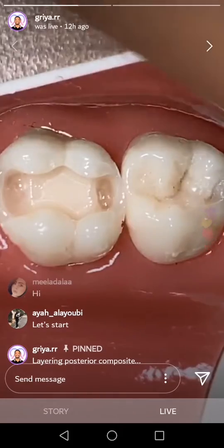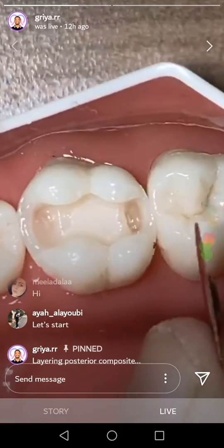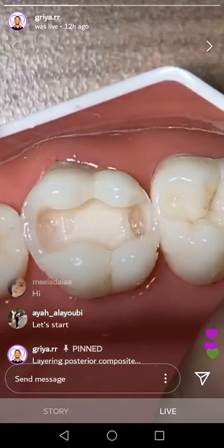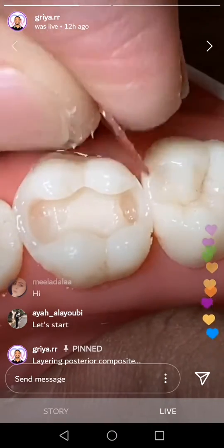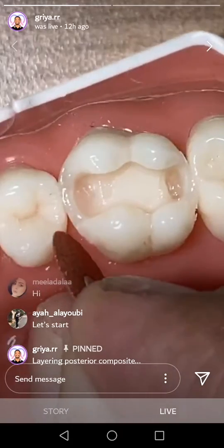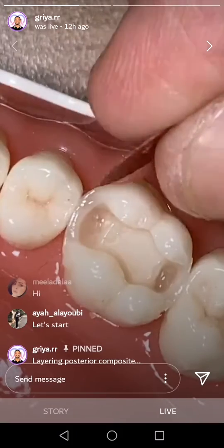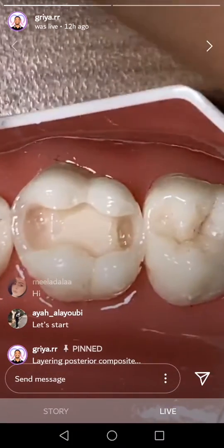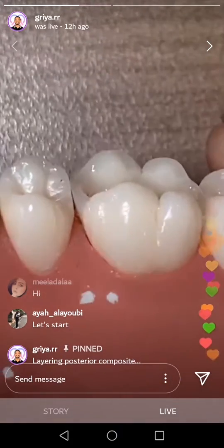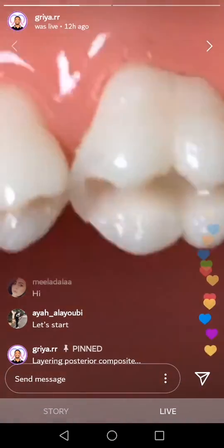Okay, you know soft flex with disc. It's very easy for you to like this, yeah. Thread, thread, thread, and this one again. Thread, thread, thread. This side again. This one again. Okay, later. So now you don't need to do that. See the contact. See, I'm not lying to you.